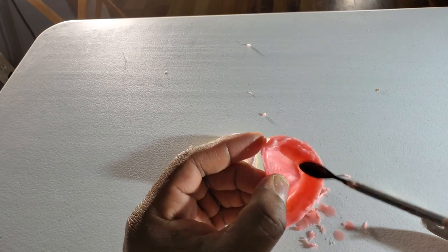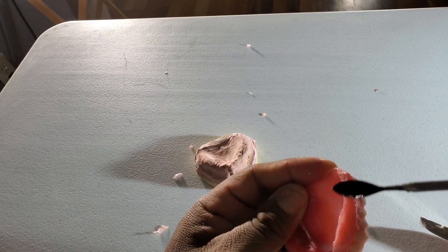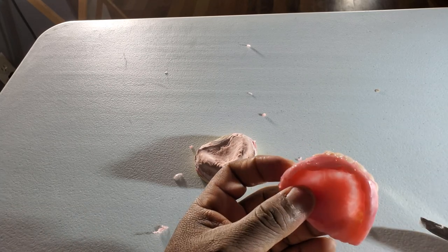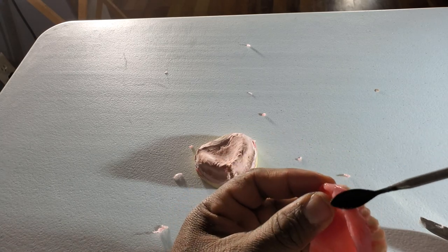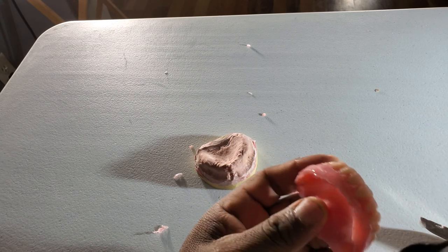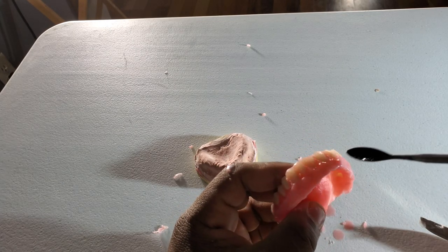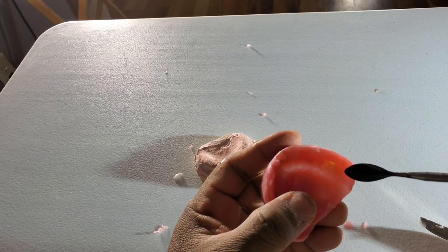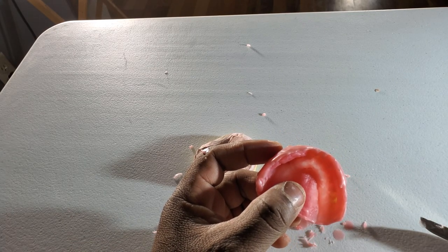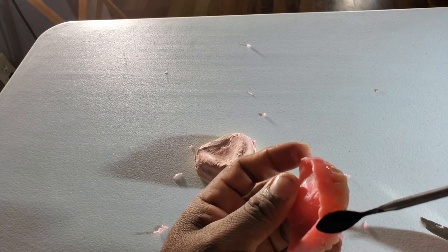Smoothing things out so it doesn't bother you when you do your wax try-in. Remember you don't have any type of professional tools — you're just doing it with whatever you have. I'm using a spatula. You can find carving instruments online — they have them on Amazon, and I've seen them at Hobby Lobby, Michaels, because a lot of people do small art and carving tools are always available. In the Dremel section at Home Depot or similar places they also carry carving tools.